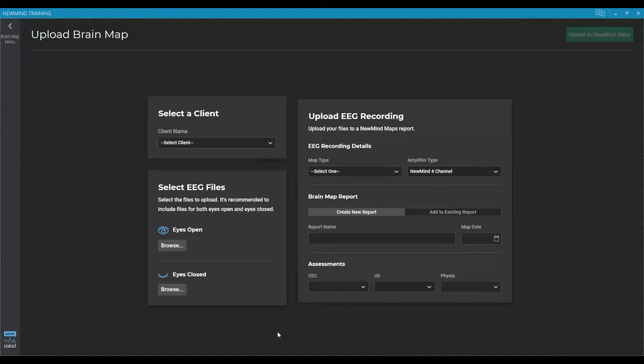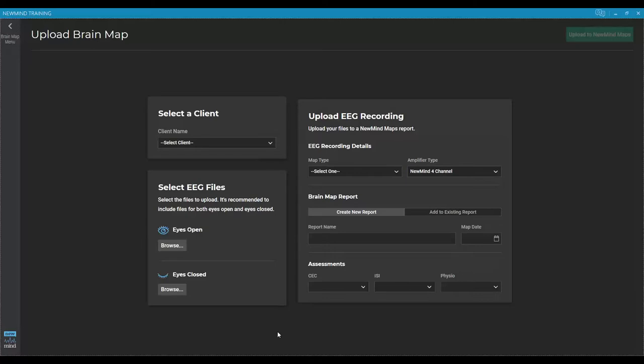Okay, so once your file has successfully uploaded, it will come back to the upload brain map screen. If you needed to upload additional reports for other clients, you could continue the process we just went through. If this was the only client you needed to upload, you could back out to your home screen.